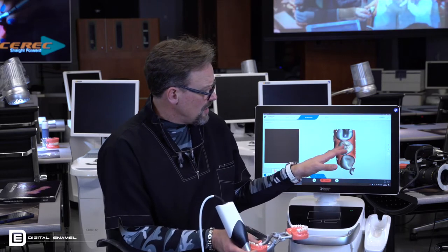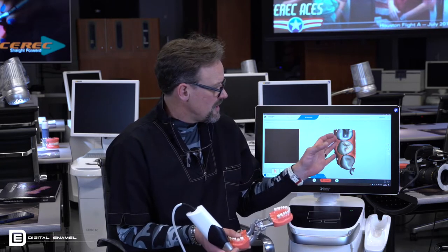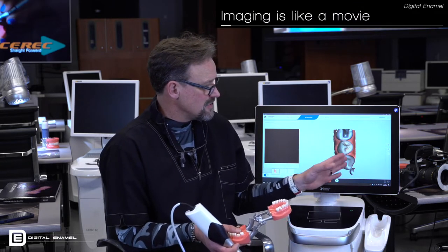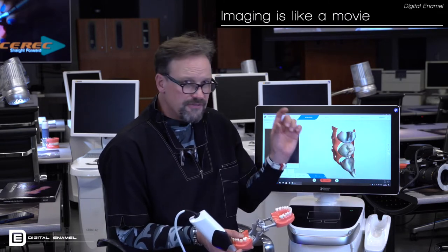So we have a model here, and the way I like to think of this is I like to think of CEREC imaging as movies. The red camera and the blue camera days were single pictures, but with the Omnicam and the PrimeScan, I think of this as the movie. So what we're looking at right now is the first short little video segment of the rest of the model.